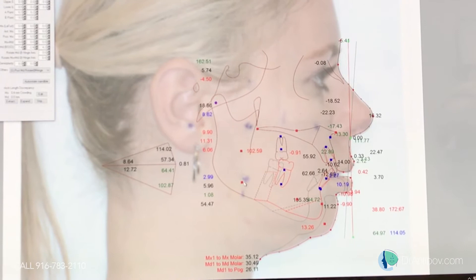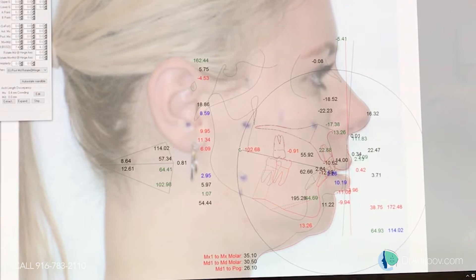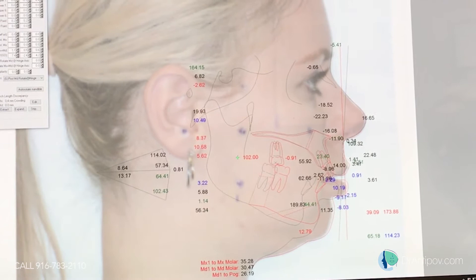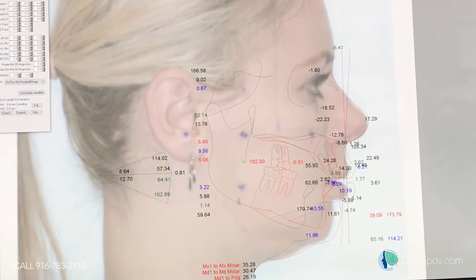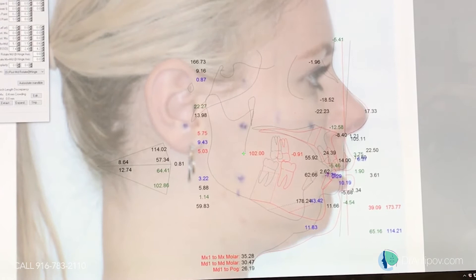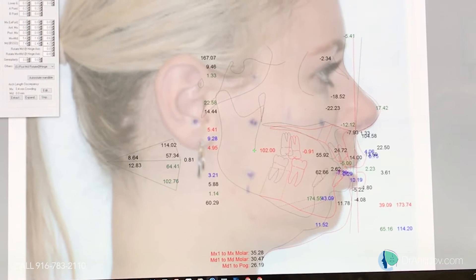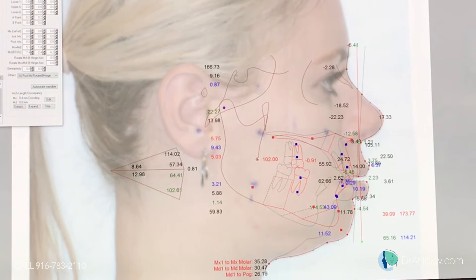We're going to move the incisal edge down and forward, approximately 4mm forward and 2mm down. Then we're going to change the occlusal plane.